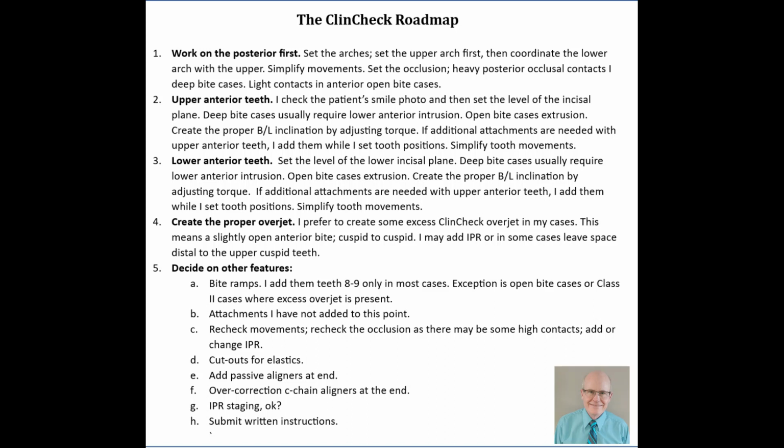I'm founder of InvisalignDoctors.com, and I'm excited to announce that I've created a new video series, and I'm calling it the ClinCheck Roadmap, the key to predictable treatment plans. I've set up hundreds of Invisalign treatment plans, and the process I use is very repetitive. I basically do the same thing for every treatment plan. So I'm going to show you that in this video series. I'm going to take a fairly complicated case, and each week I'm going to go through one of these steps. So there's 5 steps that I use to set up a ClinCheck.